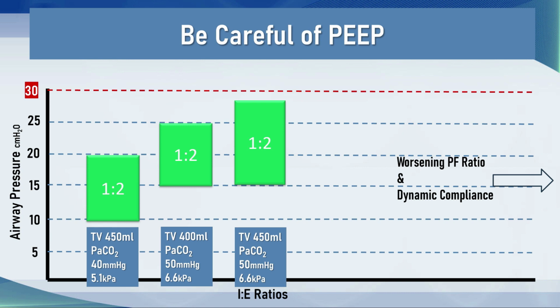So even though the minute ventilation should have increased, the alveolar ventilation has not improved. And again, this is evidence of alveolar overdistension and an increase in the dead space to tidal volume ratio that cannot be improved by increasing driving pressure. And I will point out, it really won't improve if you increase respiratory rate, because that will increase Auto-PEEP. So what are your options here?